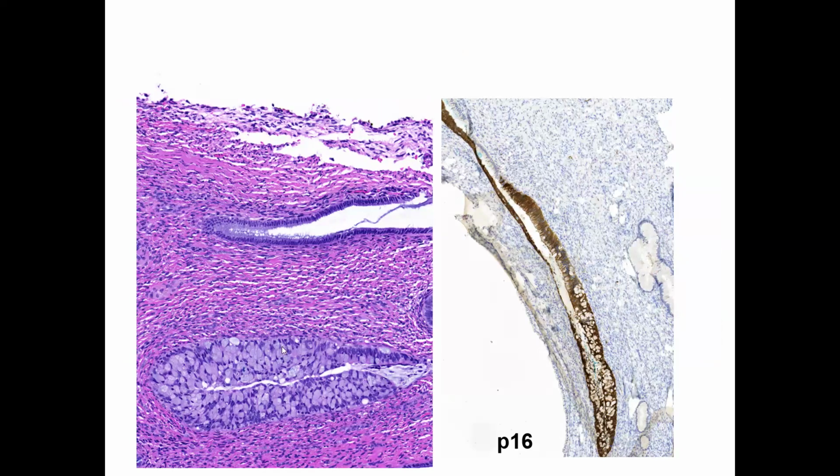So here's another SMILE case. You have to call this something abnormal, but they have mucin. They look like HSIL with mucin. And if you do P16, you can see even the glandular component of the gland here. The glandular part is positive for P16. All right.